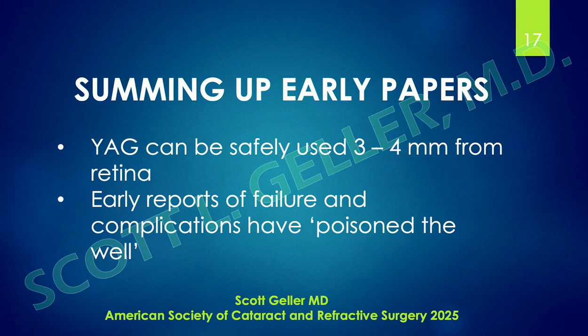So let's sum up these early papers. Most important thing, YAG lasers can be safely used 3 to 4 millimeters from the retina. And I think a lot of these early reports of failure and complications more or less poisoned the well.